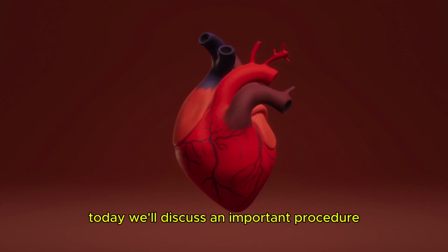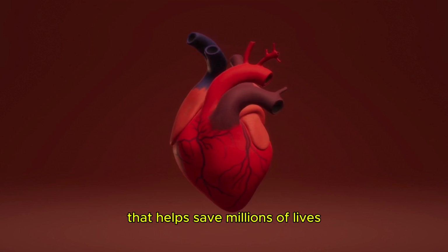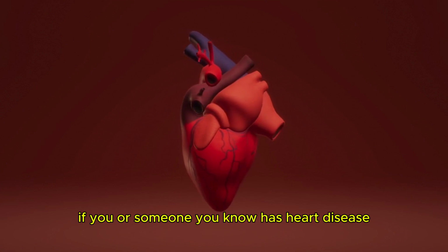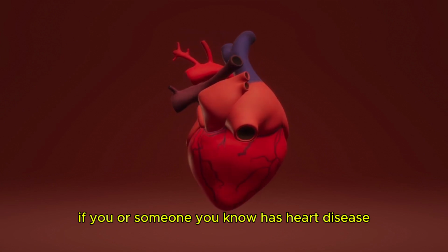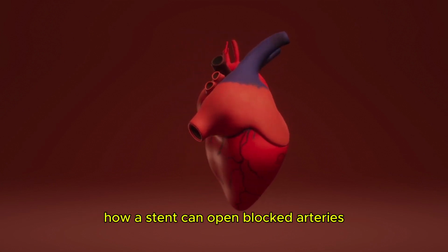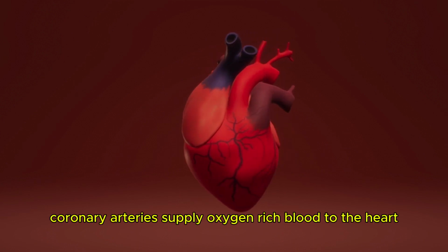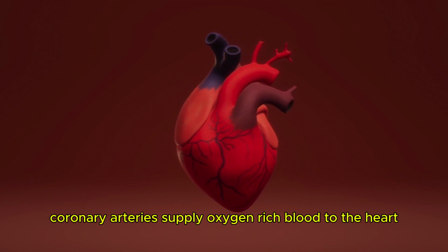Today, we'll discuss an important procedure that helps save millions of lives: stenting and balloon angioplasty. If you or someone you know has heart disease, this video will explain how a stent can open blocked arteries and restore blood flow. Coronary arteries supply oxygen-rich blood to the heart.